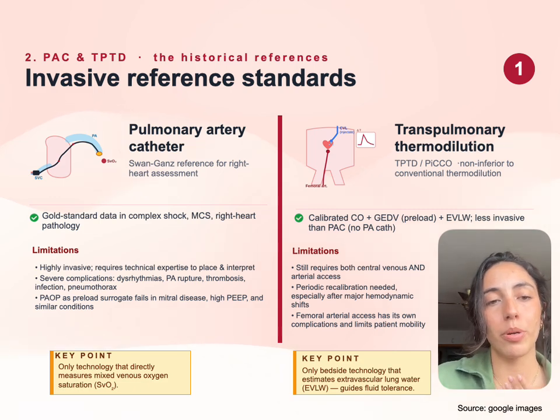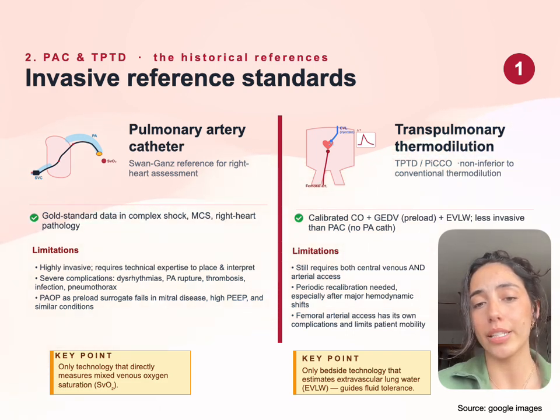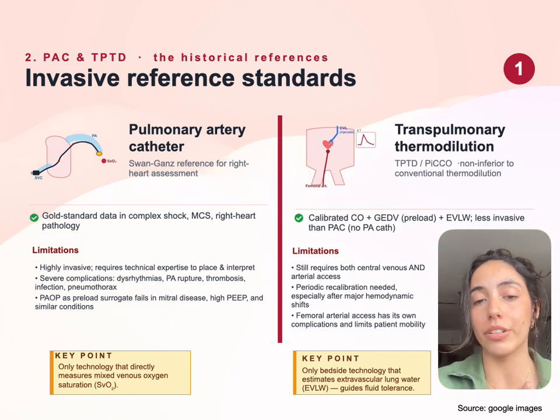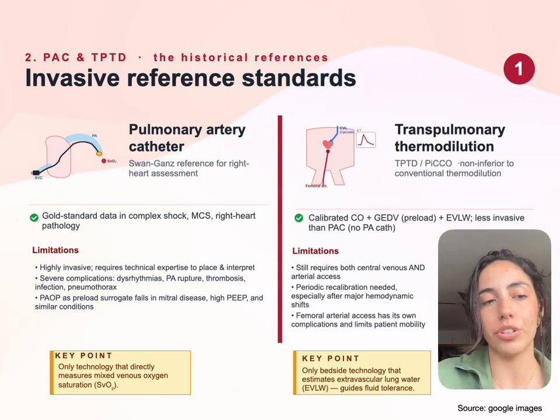In terms of the pulmonary artery catheter, as we have discussed in classes before, the pressure in the right heart is usually extrapolated to the pressure in the left, and that is not necessarily true in patients, for example, with left heart pathology. And it can be dangerous to rely on these parameters as fact when we need to understand the physiology behind what we're measuring in order to reliably understand the patient's status.